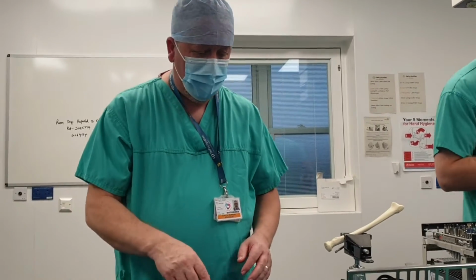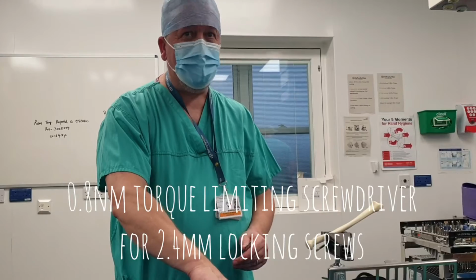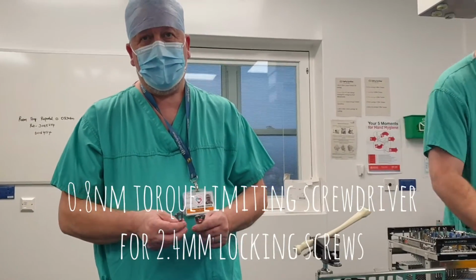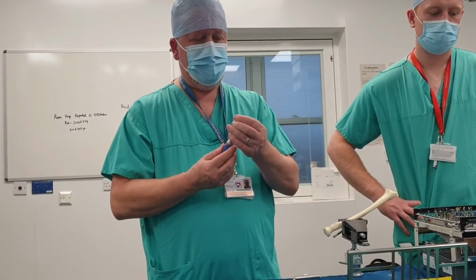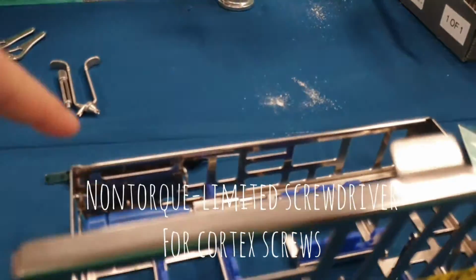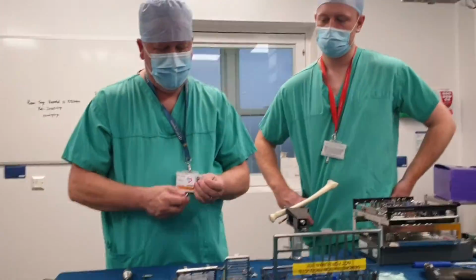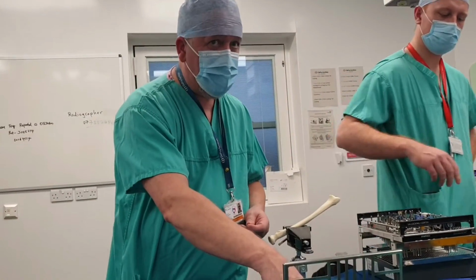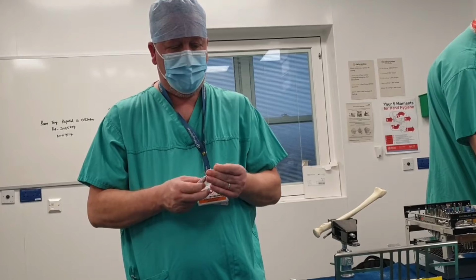Now what you have, we have torque for locking, isn't it? The only other screwdriver is the Cortex screwdriver, because there's another one there, isn't it? This one is not torque limiting, and that's not torque limiting. Sometimes they want to use the cortical screw, which is probably why they want the 2.7, but they don't need to.